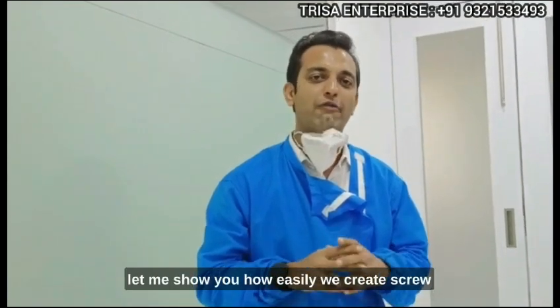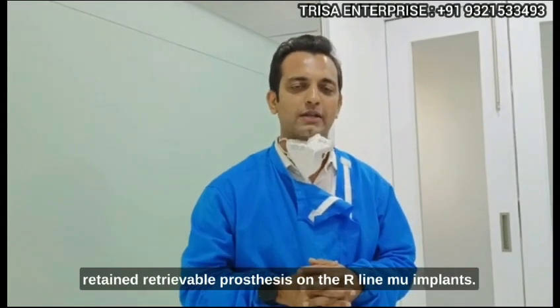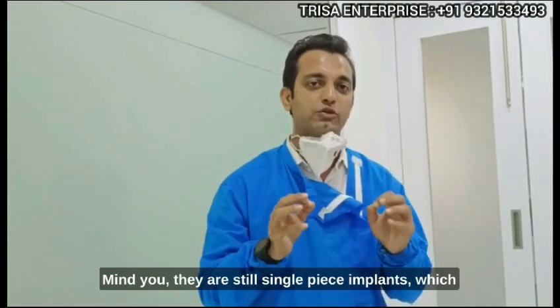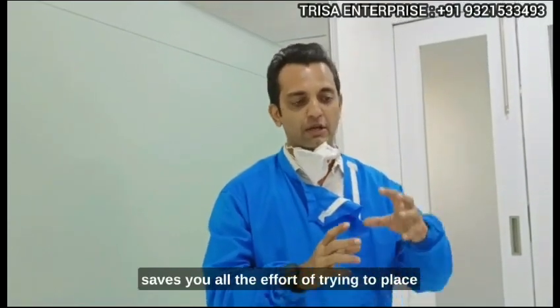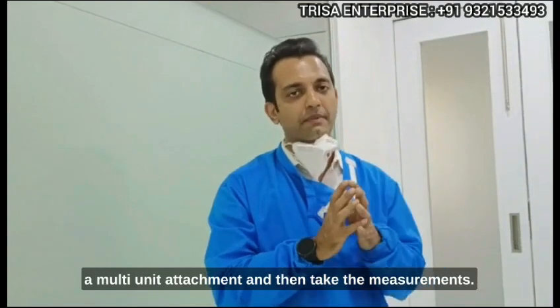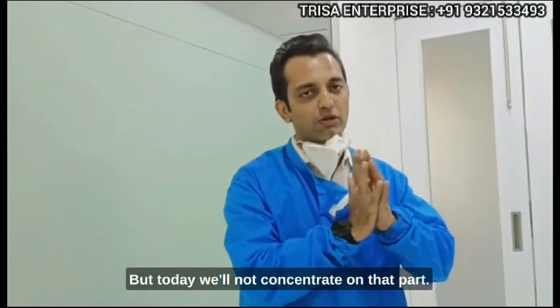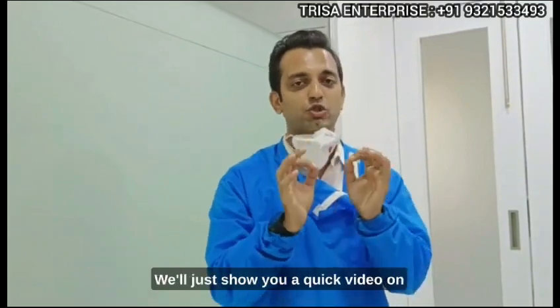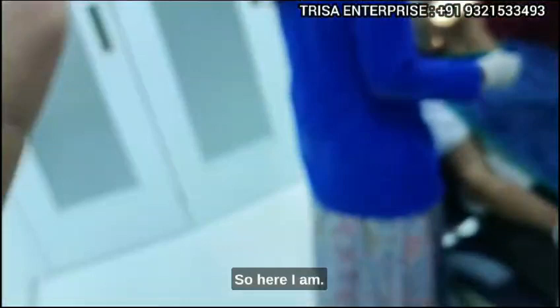Now with the R-line series of MU implants, let me show you how easily we create screw-retained retrievable prostheses on the R-line MU implants. Mind you, they are still single-piece implants, which saves you all the effort of trying to place a multi-unit attachment and then take measurements. It's a single piece with MU implants, but today we will focus on showing you the retrievability.